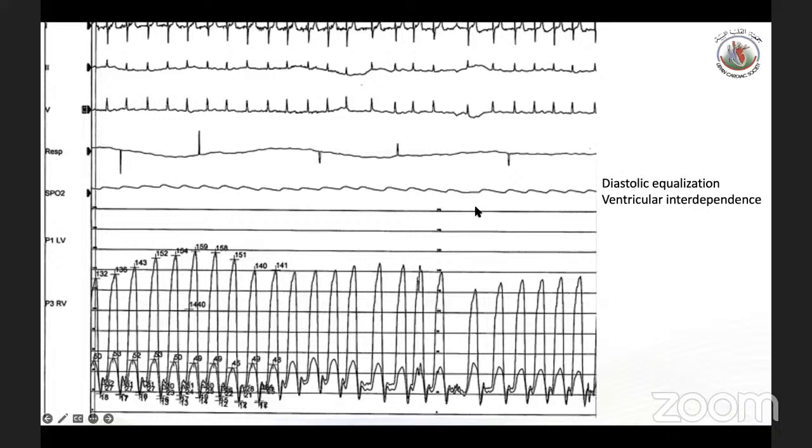for hemodynamic monitoring. The other comment I want to make is for those who come to me, especially with valve disease, and a lot of these guys usually have pulmonary hypertension, especially the mitral cases. Unfortunately, the pulmonary hypertension in echo is not always well documented, either because of an inadequate tricuspid, like a TR jet, or maybe it's not a really detailed echo. And you have a SWAN in the operating room and you find the PA pressure is like 68/37, so it's at least moderate to severe pulmonary hypertension.